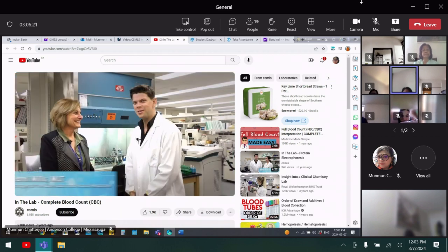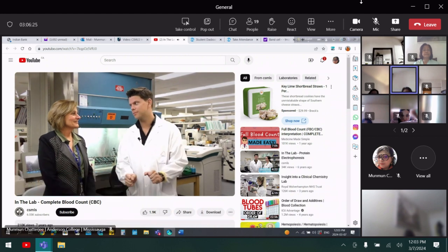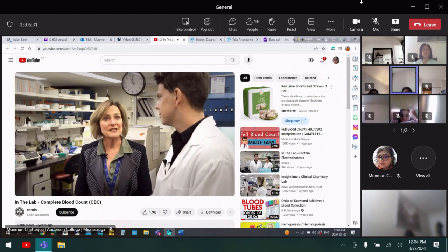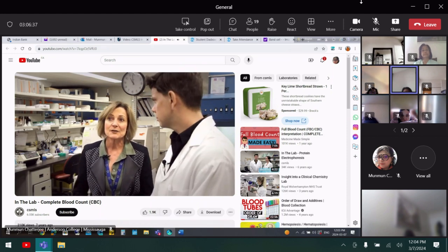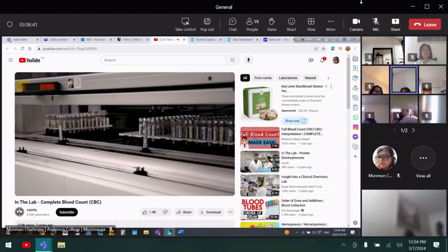I'm here with Marnie. She's the manager of Core Labs and Rapid Response. Now, Marnie, why is it called Core Labs? So the Core Lab consists of very high volume routine testing, coagulation, hematology, biochemistry. But in this area, we also have some of our specialty areas that incorporates hematology and chemistry.